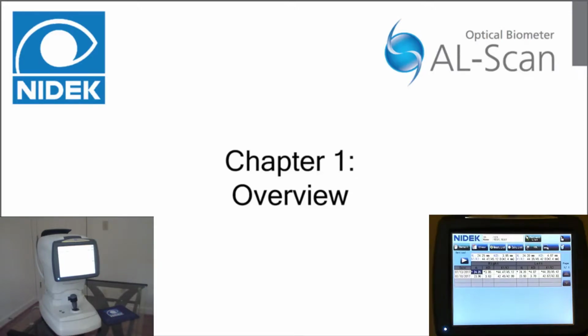The AL Scan also performs calculations to assist physicians in determining the power of the intraocular lens for implantation.